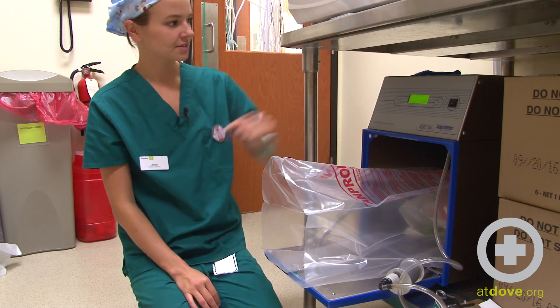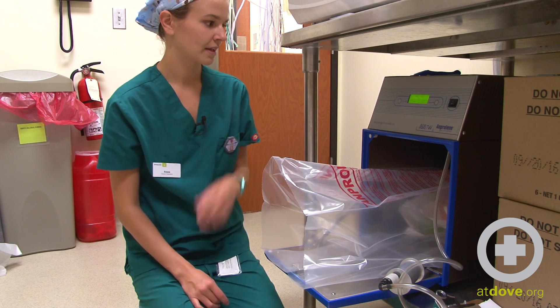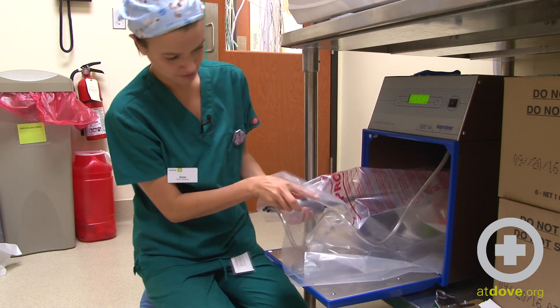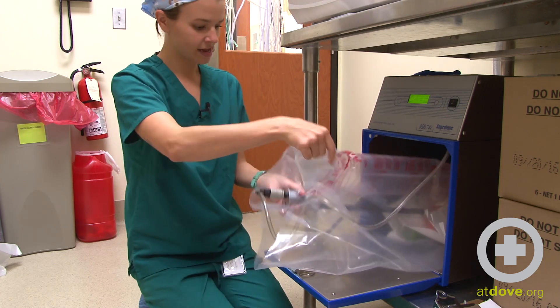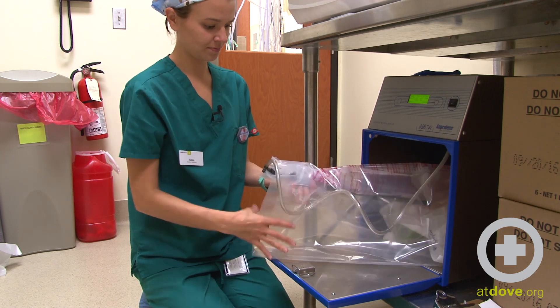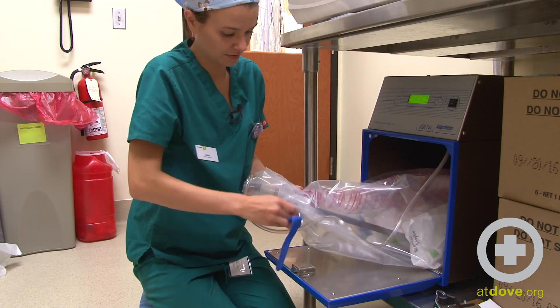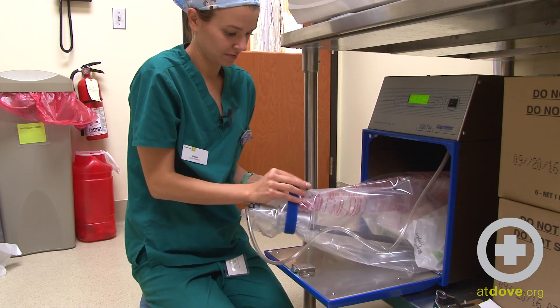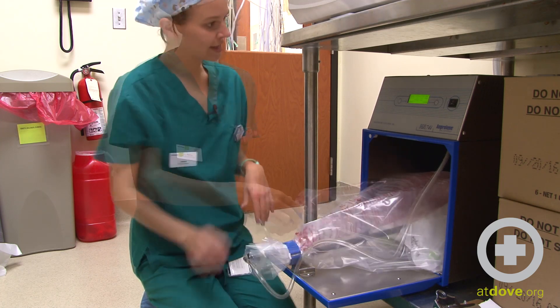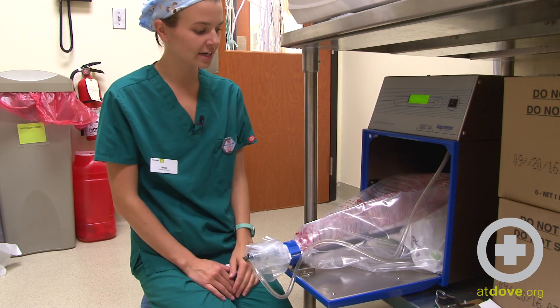The next thing I'll do is I'll hit Start. Then I will enclose the top of the bag around the vacuum like so. And then I will hit Purge on the sterilizer, and that will remove all of the air in the bag.